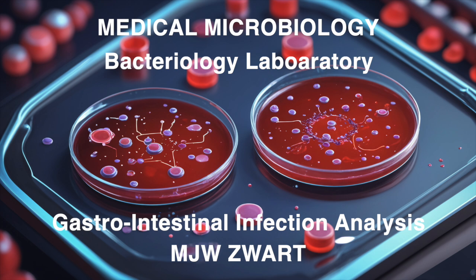Interesting. So even though the PCR was negative, we're expanding our search based on those other clues. Exactly. We check our bacteria recipe book, find the right media and conditions for those less common pathogens, and if we see anything suspicious, we need some more tests to confirm. And then sensitivity testing to guide treatment. You got it. This case really shows how we can't just rely on PCR. We need to use all the information we have. It's like being a detective, you know? I'm loving this detective work.